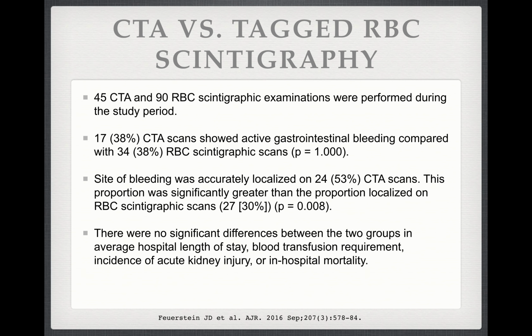In theory, it is believed that CTA is less sensitive. I'm not sure that is true, as evidenced by the last example, and particularly may not be true in the modern era of dual energy CT, where we can find really, really subtle bleeding.